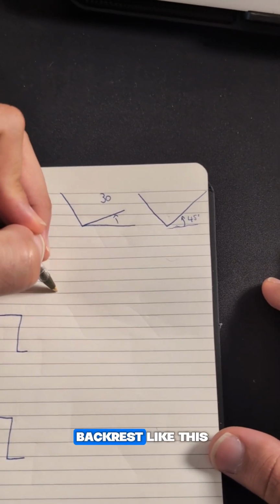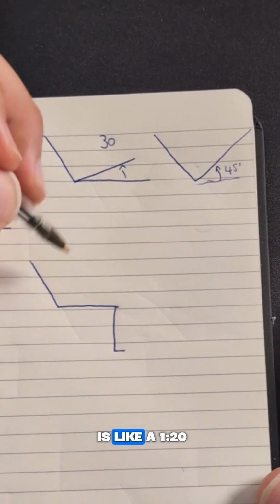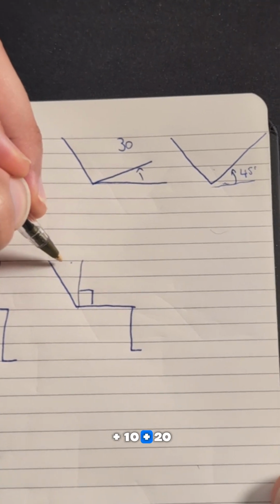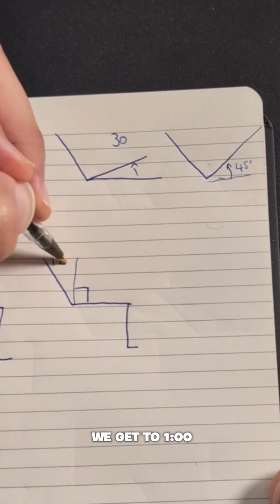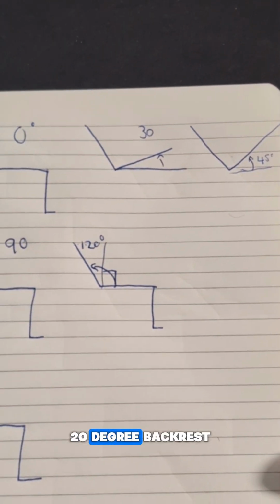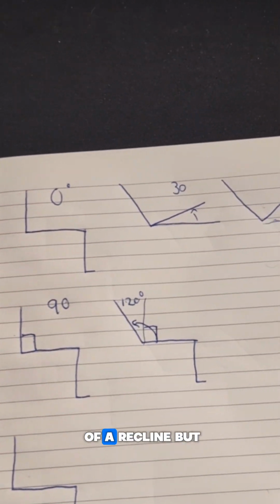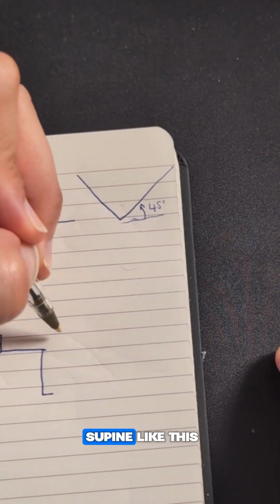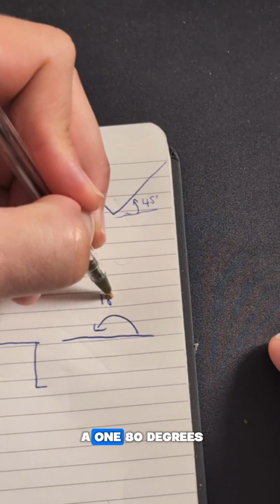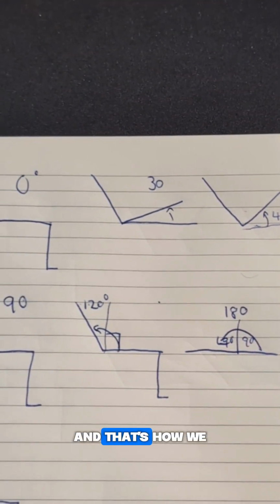Great. Backrest, this is considered a 90-degree backrest, meaning from here to here is 90 degrees. As you recline the backrest like this is typically what you'd see. Maybe this is like a 120. So we have 90 plus 10 plus 20 plus 30, and then we get to 120 degrees. So from here to here is a 120 degree backrest. So backrest will usually sit at about like 100 degrees, somewhere around that, like a little bit of recline. But if you go full supine like this is what's considered 180 degrees, because we have 90 plus 90, and that's how we get 180 degrees.